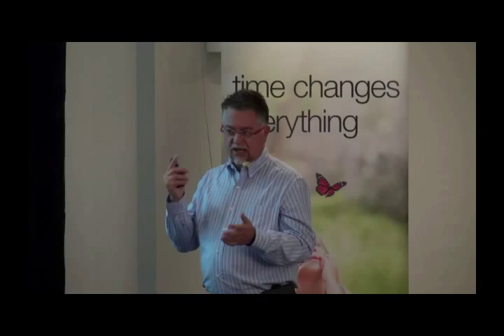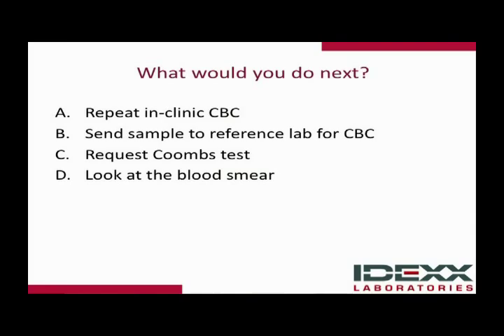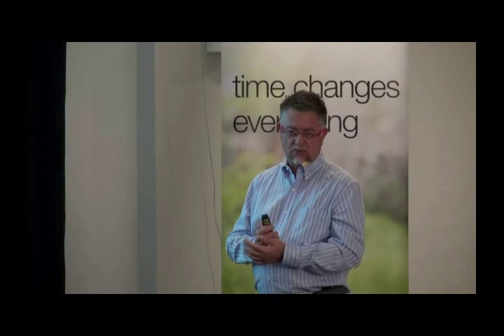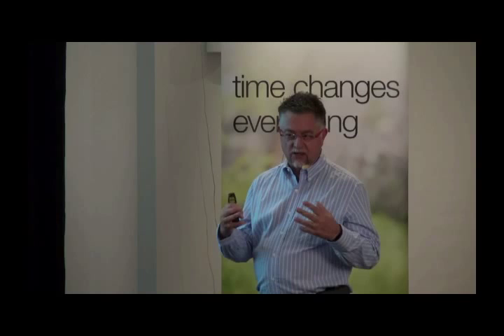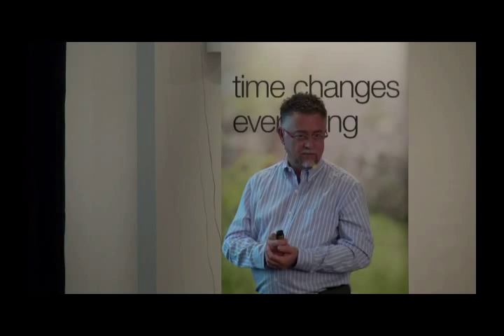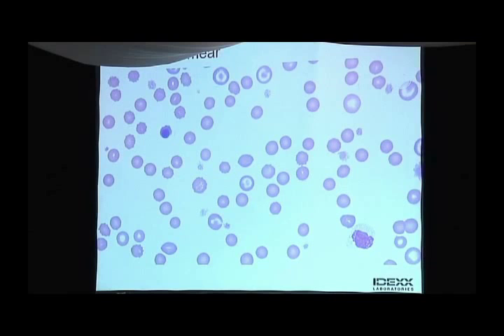Do you want to do a Coombs test or do you want to look at a blood smear? Let's think about expense and promptness of the information. And I understand that by religion, you do not use the microscope. I understand that. But if you were to be inclined to potentially use that optical device, would you be looking at that smear? See? All right, good. So what I'm going to do is show you a video of the blood smear on Toby, all right? That's a nucleated red cell. That's a busted, probably monocyte.